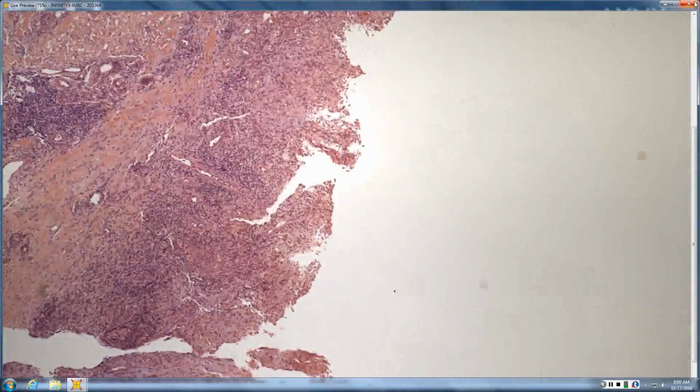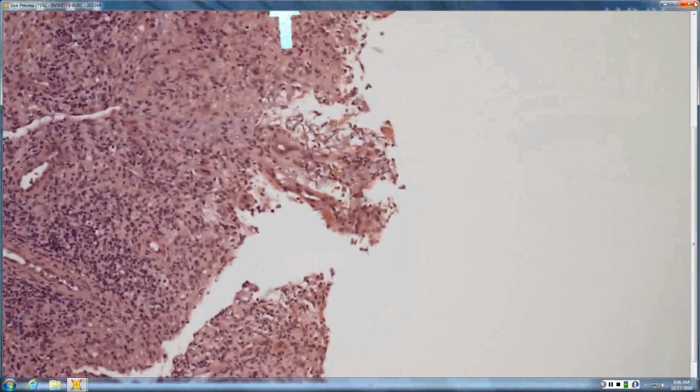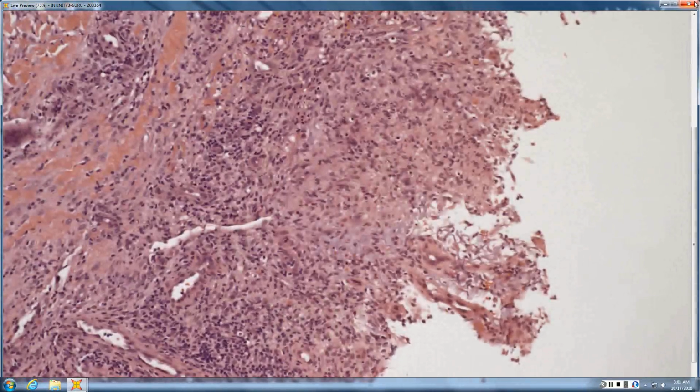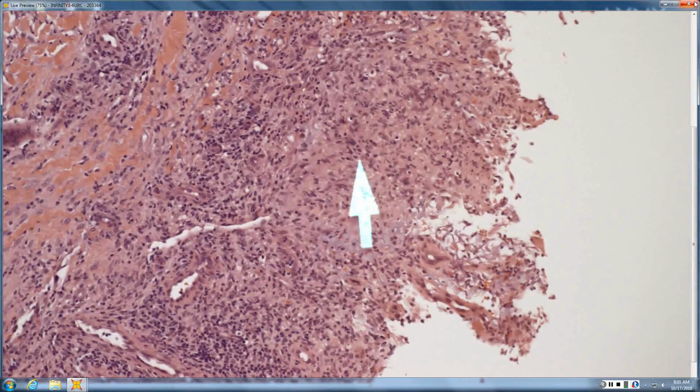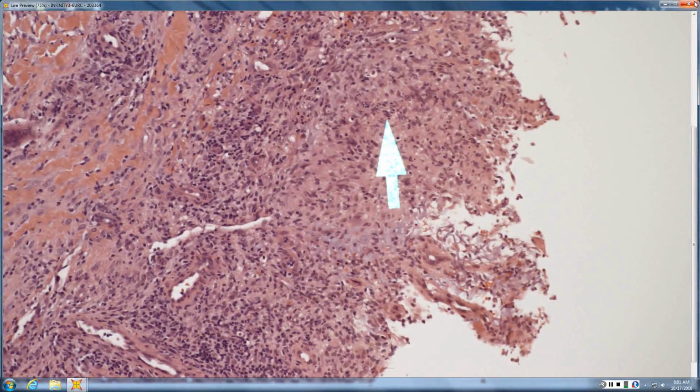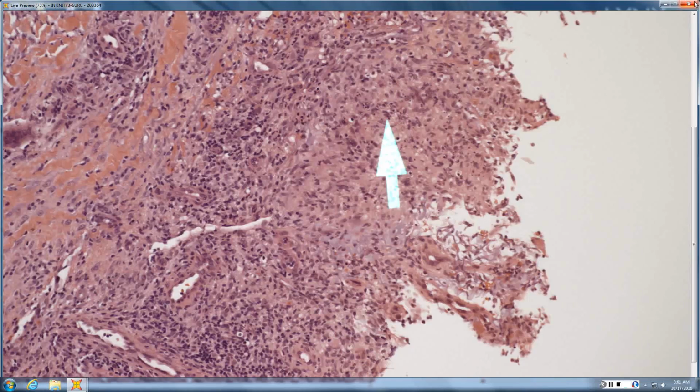Down in the dermis, it's looking a little different because you have palisading granuloma with neutrophils in the center. So that makes you think of it more being like a fungal etiology, like it's trying to block it out, than just a folliculitis. Yeah, so it raises the possibility of invasive fungal infection. Sometimes those neutrophils will get to the point of a stellate abscess inside of a granuloma. That gives you a little bit different differential: cat scratch, LGV, atypical mycobacteria, tularemia, sporotrichosis. So you've got to run two parallel differential diagnoses and work through all of those possibilities. And this particular one grew atypical mycobacteria, which means you nailed it pretty much at scan when you said it looks like maybe something infectious.